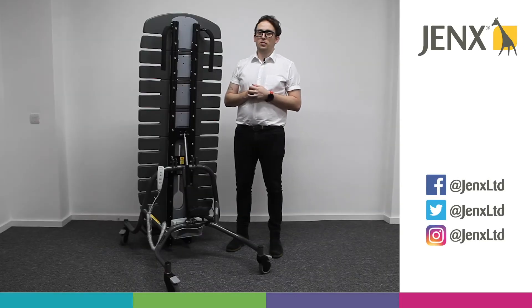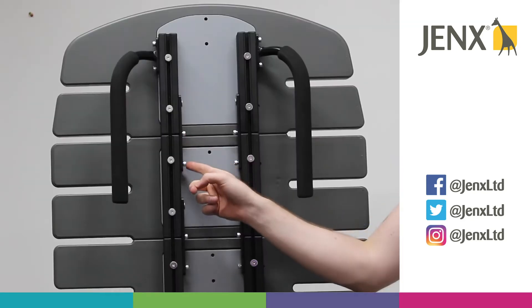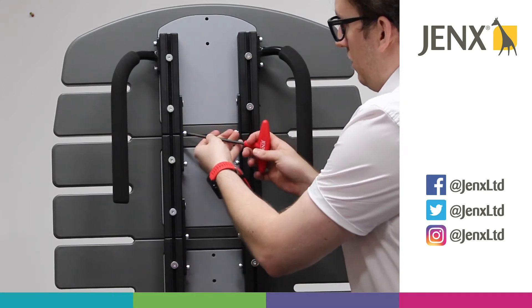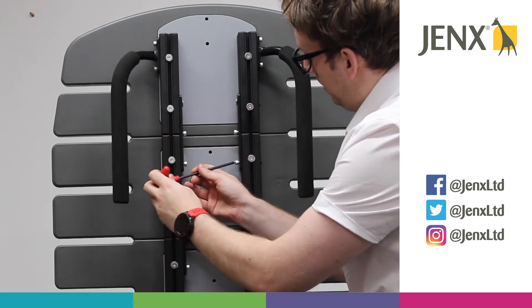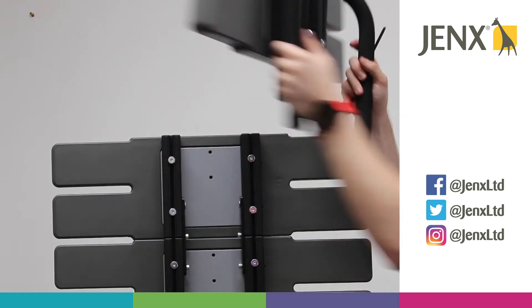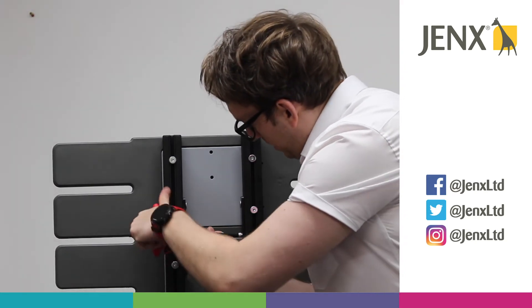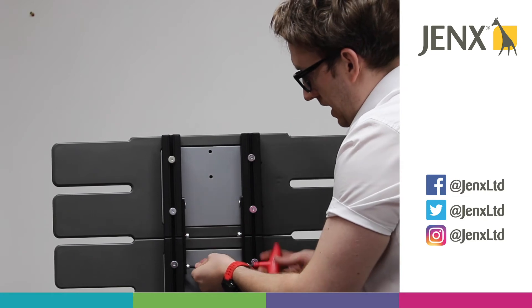We're going to remove some of the support boards on this new Supine 3. We've got four allen keys here — if we loosen these off, we'll be able to remove the top section of the board, and that slides off. We're able to do that with two sections, so again we're just going to loosen those allen keys off.